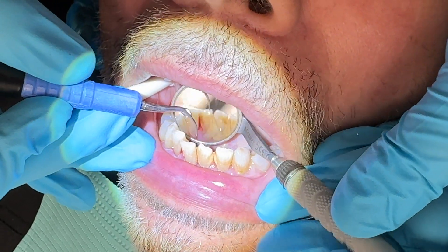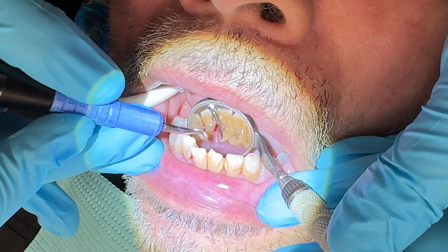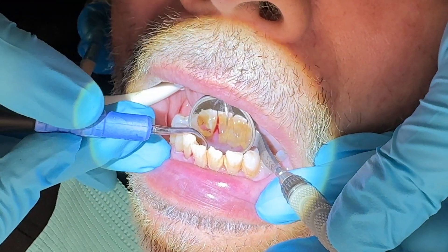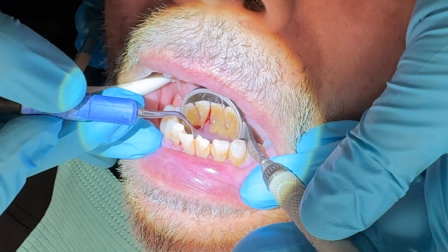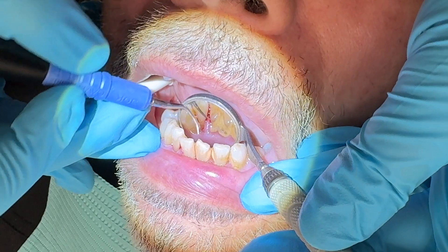If you see this lower anterior calculus, it's very tempting to take your tip and get down here and try to pull it off like you would a hand instrument. But if I do that, I'll show you — it's going to burnish and not get as much off. The correct approach is to start at the top of the deposit and get down towards the calculus — you'll see how much more efficient it is. It's just how ultrasonics are designed.